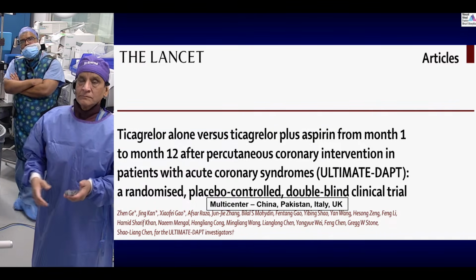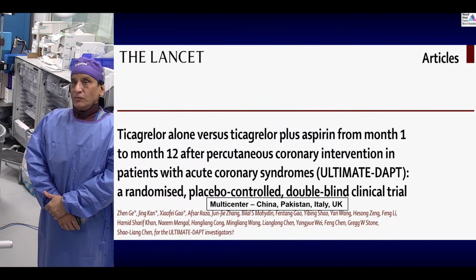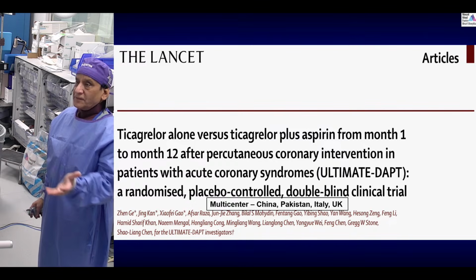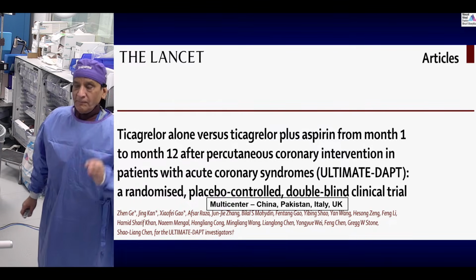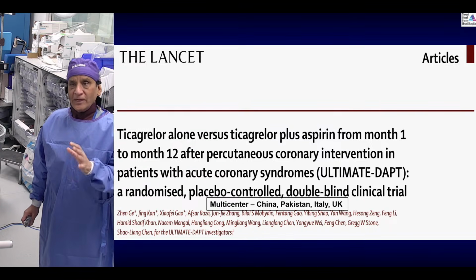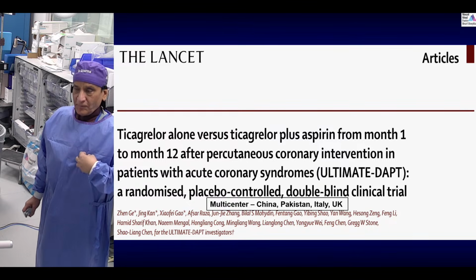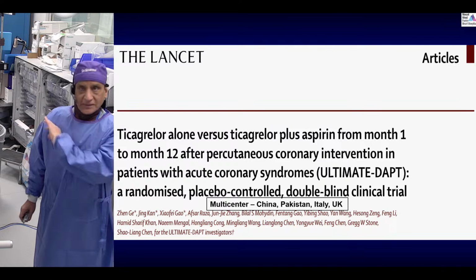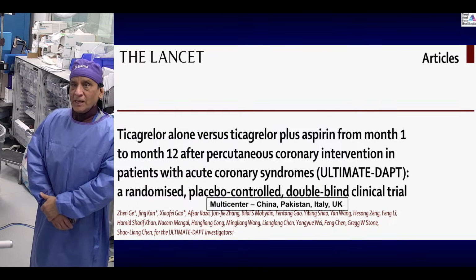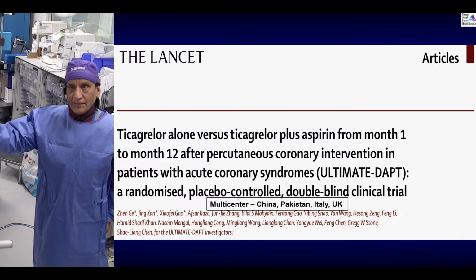You think a smaller device would also impact the renal complications? That I do not know. I think this came as a side kick of the trials, that in some cases the Impella decreased the serum creatinine and decreased the AKI. I'm not fully convinced of that, because those are from retrospective data. We looked into our data when we published the Impella versus no Impella and severe LV dysfunction, and we did not find any difference in the creatinine. Some studies have shown this, but this is the first randomized trial which has shown no difference, and many of them are still coming, and then we'll know.